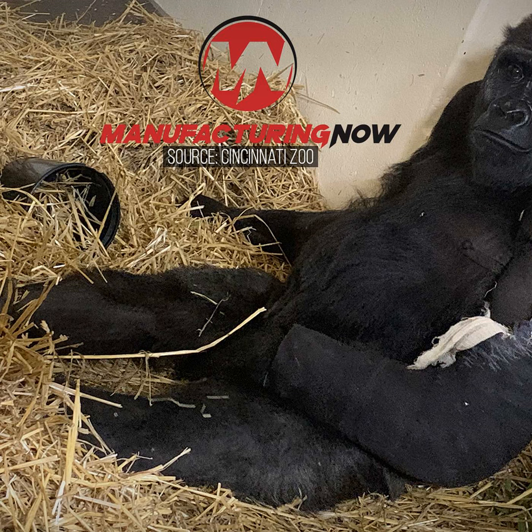3D printed casts like the titanium model fabricated for Gladys have obvious benefits like resistance to being torn to shreds by a curious gorilla. But 3D printed casts are also options for humans, and they come with a separate set of pros when compared to traditional casts. The Mayo Clinic in Florida has been experimenting with 3D printed casts, which it said can provide a more hygienic experience for people recovering from fractures.